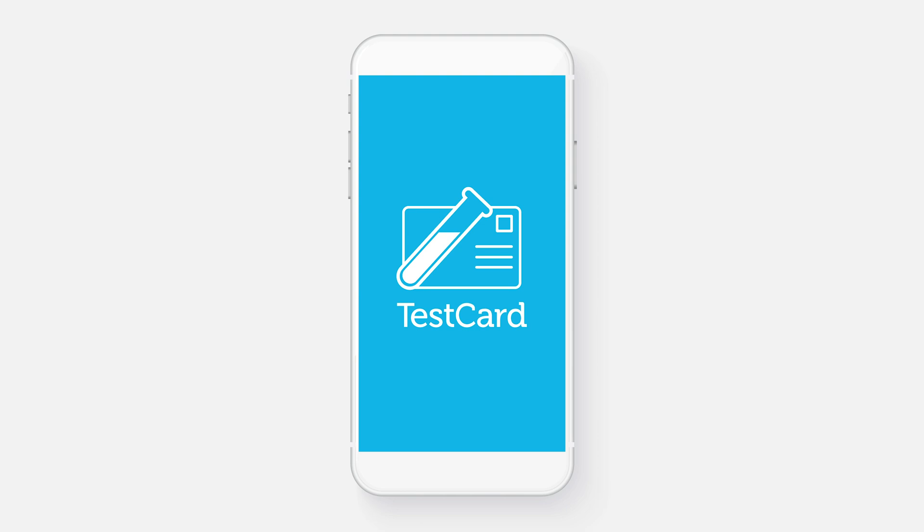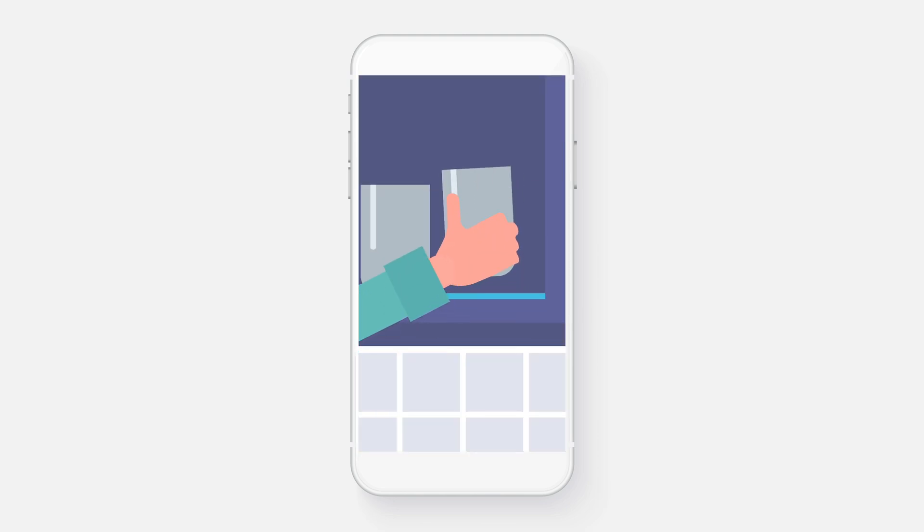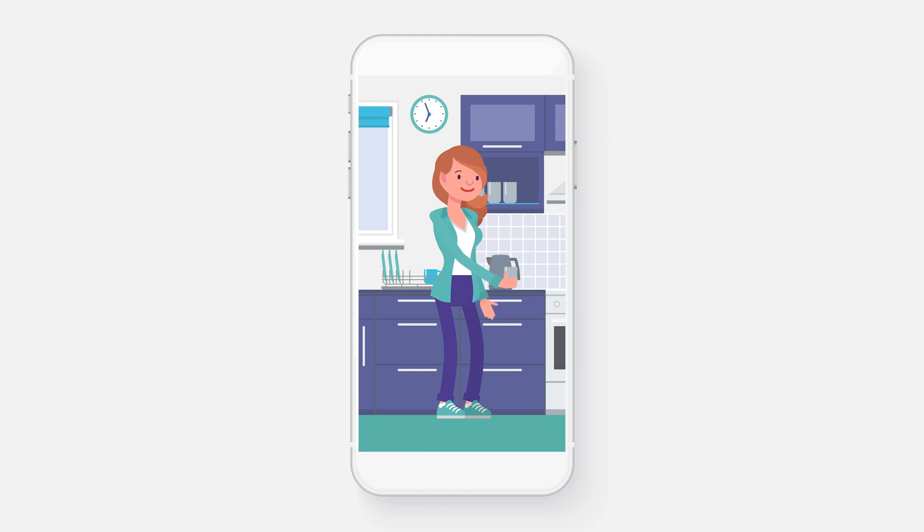Using the test card is easy. First, get a clean container to collect your sample. Any size is fine.